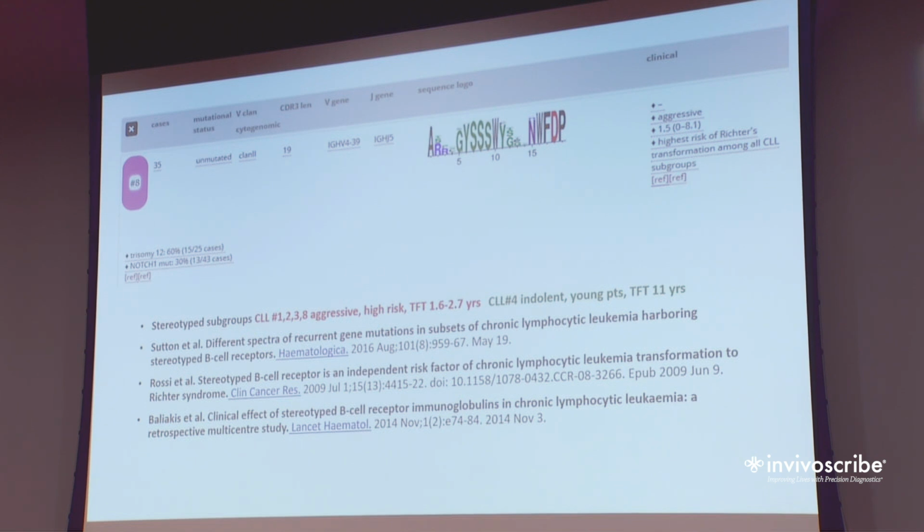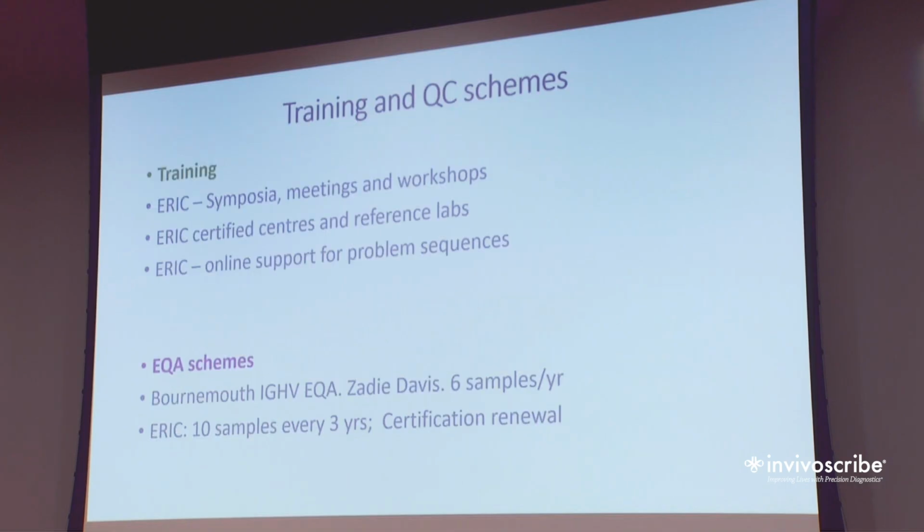You know, so these are the various different papers I've put up for you here. And sorry, the one last thing about the subsets: you'd only report on about the 4 major subsets. They're the ones with the strongest data behind them. There are other subsets, but the data would be very limited in those groups. So I'd advise caution if you are going to report on them, and say that it's a very limited data set.